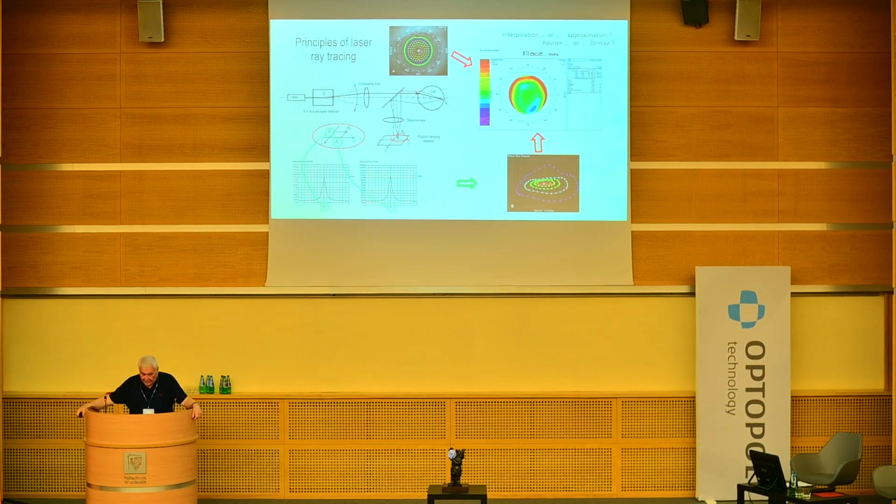And on the right lower bottom, you see the black quadrant with the points. Which are the points? It's the projection on the retina. When you have the projections on the retina, you have the coordinates on the retina, and you have the coordinates of entrance into the eye, so you can calculate the tilt. So you have all the information to build the map.